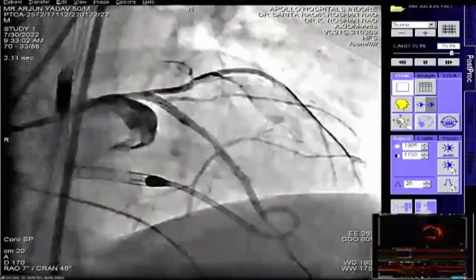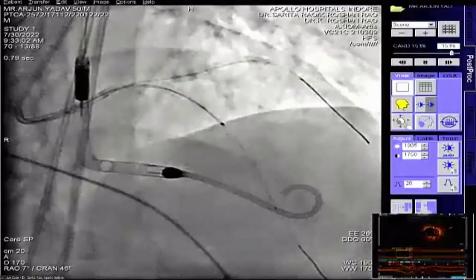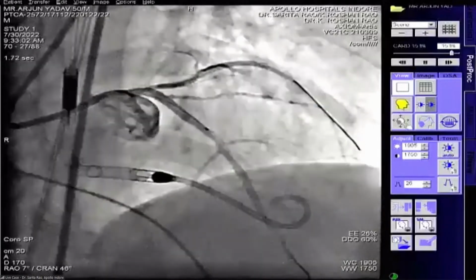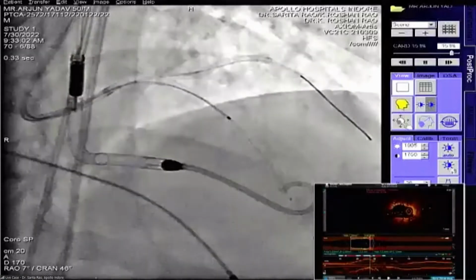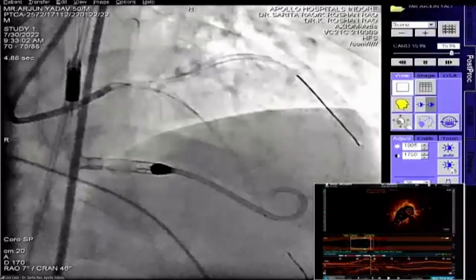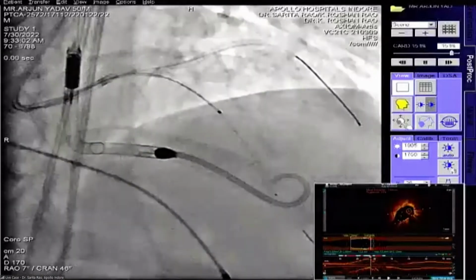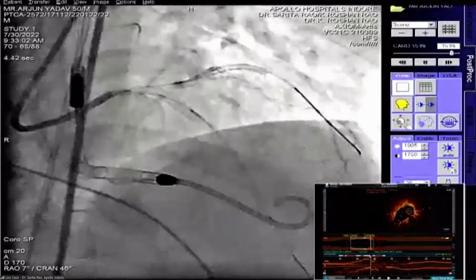But that said, we did not see any lesion angiographically before. We did see some stent struts, I thought. So it may be worthwhile to rewire and at least balloon dilate the stent struts so that they abut on the sides. Because it has been seen that if your stent struts are floating at the ostium of the circ, then you could have a fenestrated restenosis later on. Yes, a bridge effect or something.